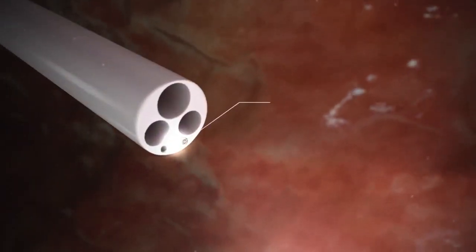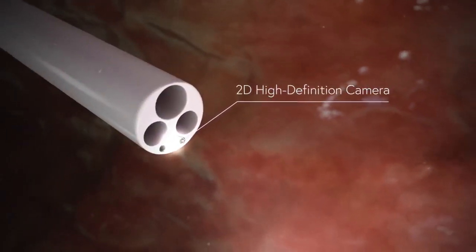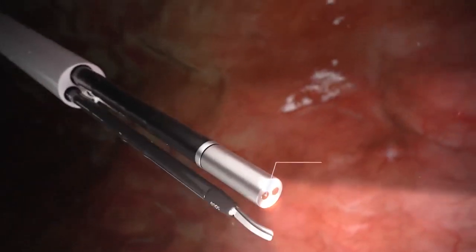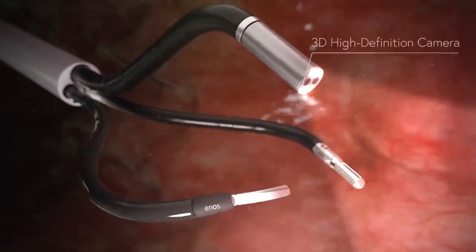The insertion cannula with its 2D high-definition camera guides cavity entry, and the retractable 3D high-definition camera moves under surgeon control, ensuring optimal visibility at all times.